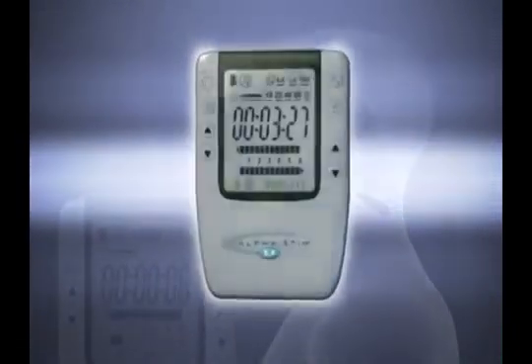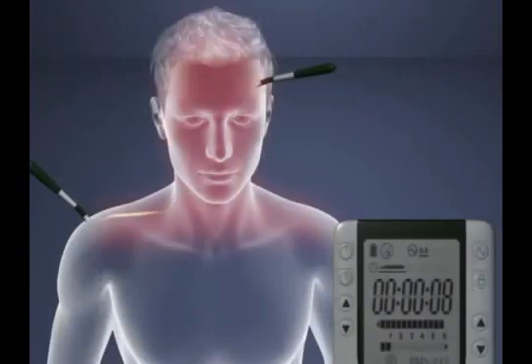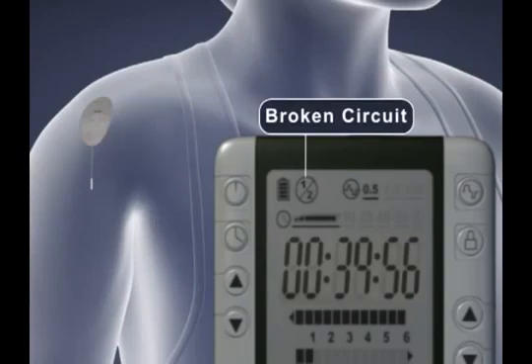life again. Because the Alpha Stim M uses such a low level of current, many people do not feel anything at all, even at the maximum current level. Do not be concerned if you cannot feel the current. This is perfectly normal, and your perception of the current will not affect the results. The Alpha Stim has a built-in test circuit that will alert you if something is wrong with the device.